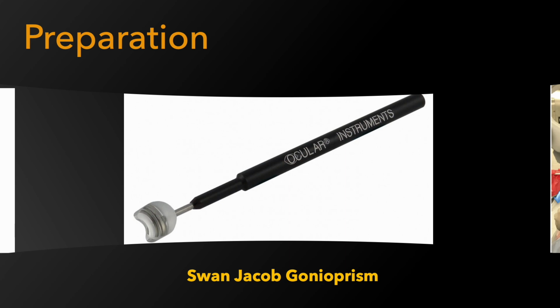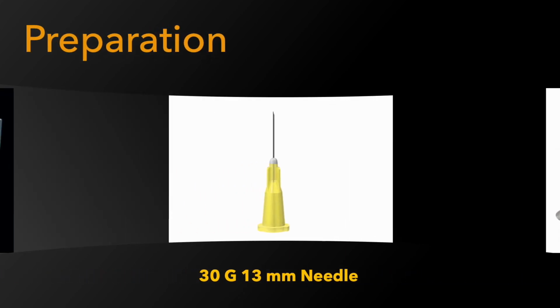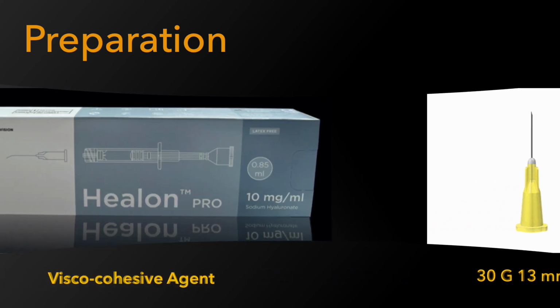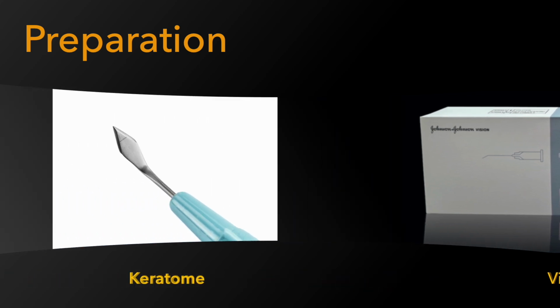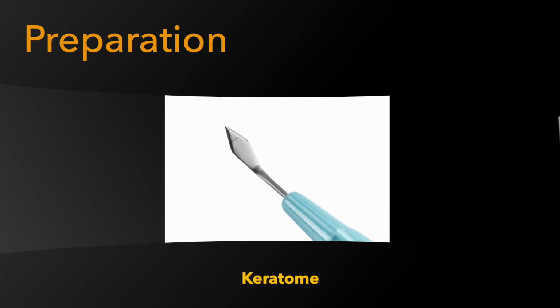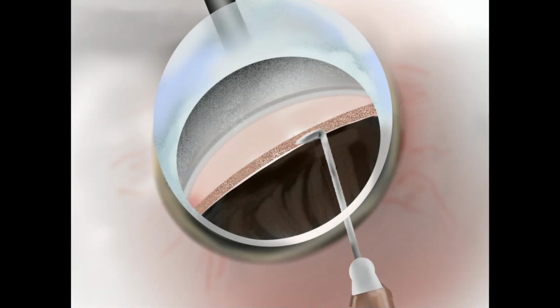For this procedure, you need a microscope with a rotatable head, a Swan-Jacobs gonioprism, a 30 gauge 13 mm needle, a visco-cohesive agent, and a keratome. This animation gives a brief outline of the procedure.